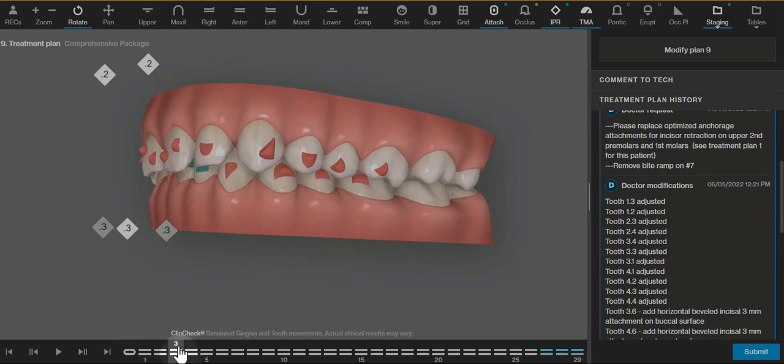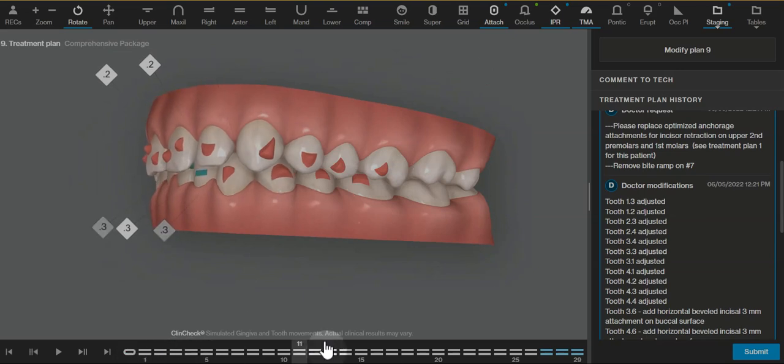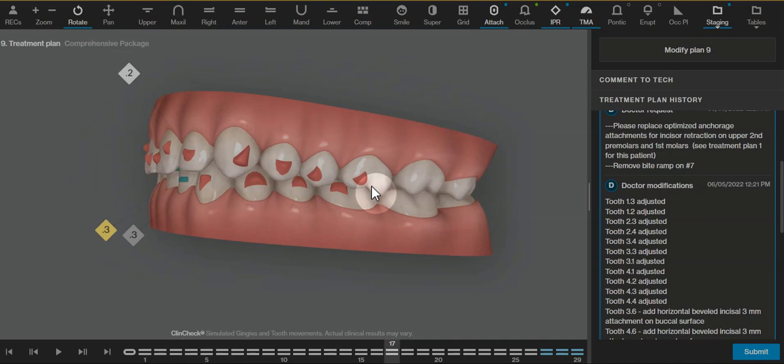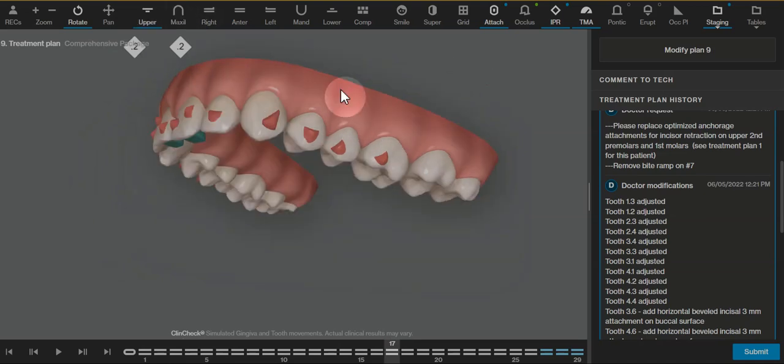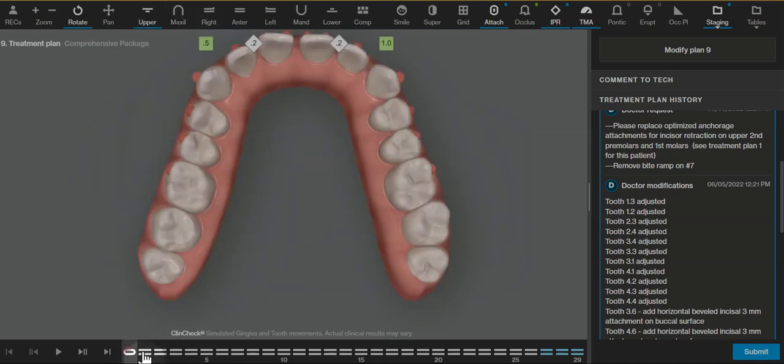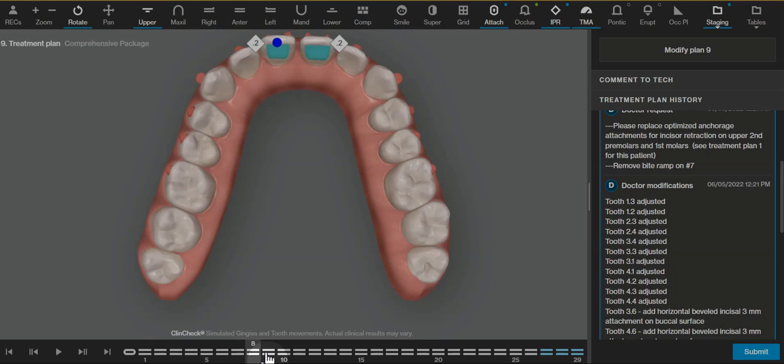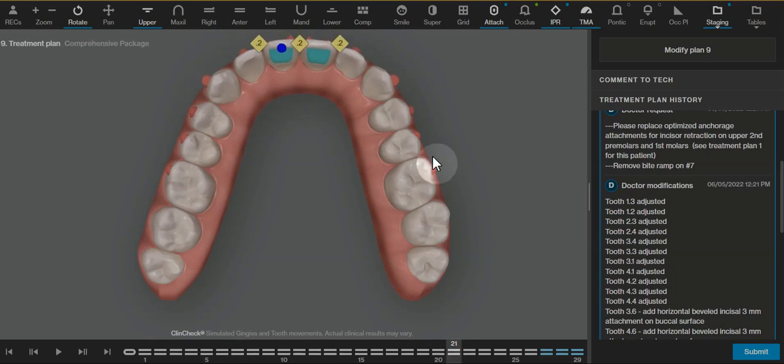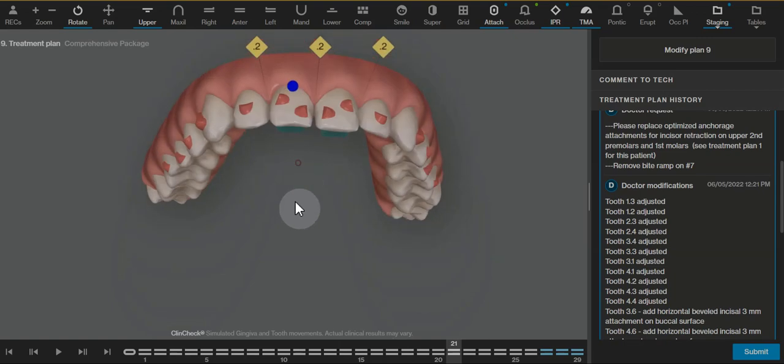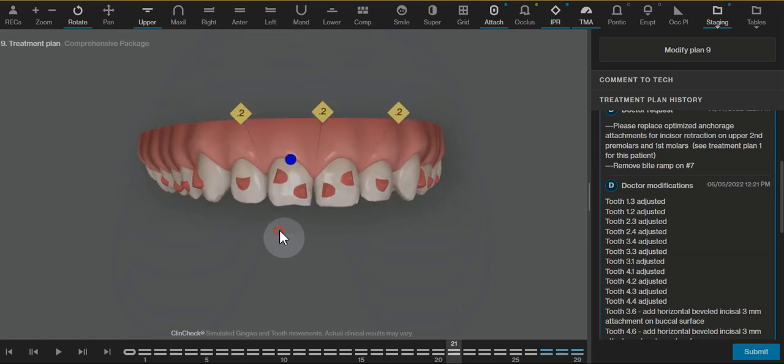Otherwise, when we do a large retraction, the molars tend to want to lean to the mesial to try to fit into this aligner that's getting technically shorter from anterior to posterior. So by not moving these teeth, we're ensuring that we're getting better anchorage and more predictability with the upper anterior teeth.